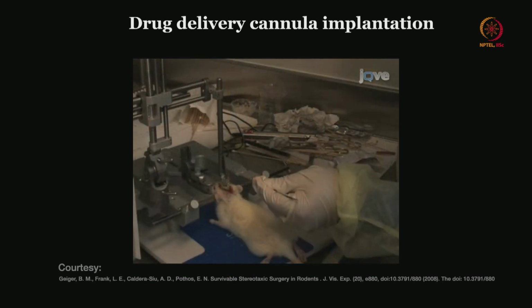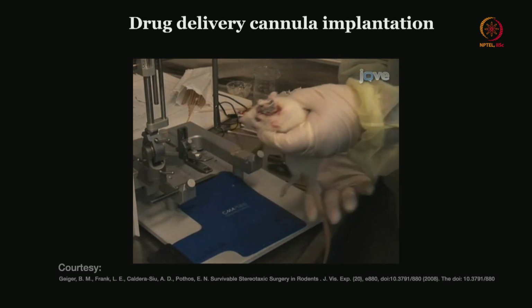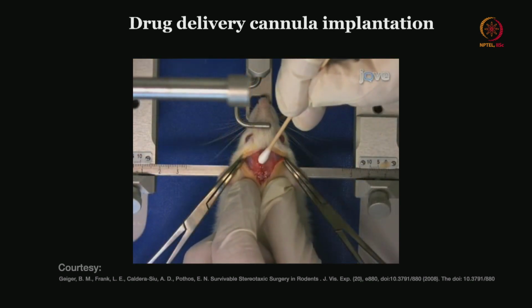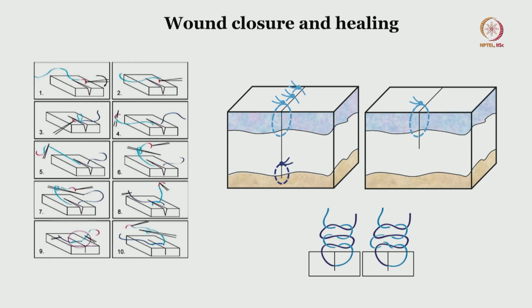Once that is done, you dismount and dismantle it from the adapter and then allow the rat to recover, and you can even add an additional tissue glue. Alright. So that is about the drug delivery cannula implantation. So that completes our stereotactic surgeries.